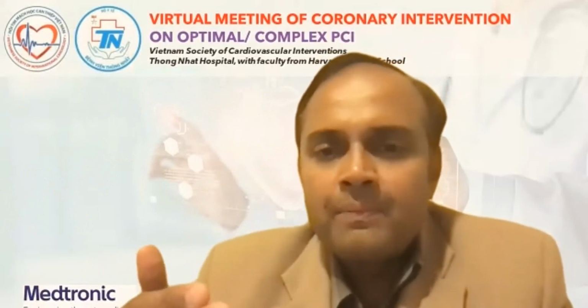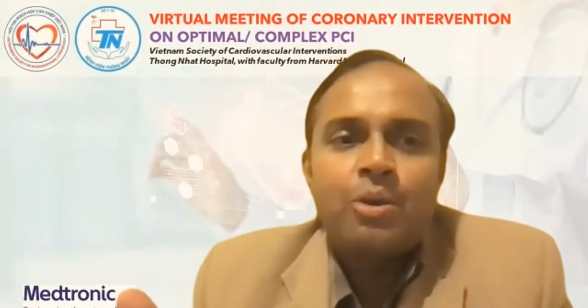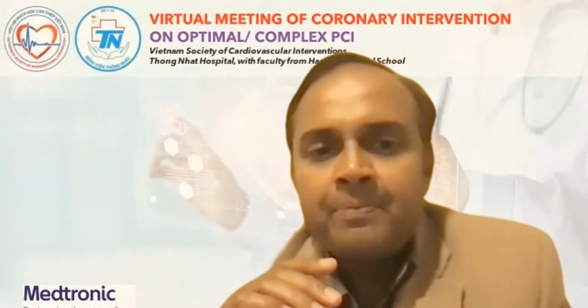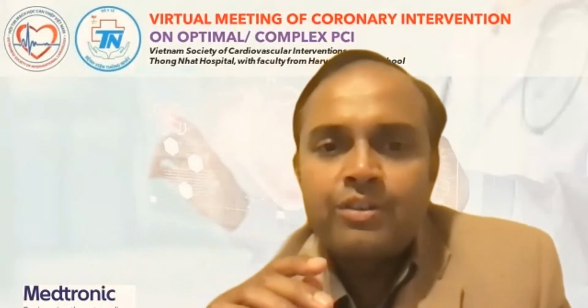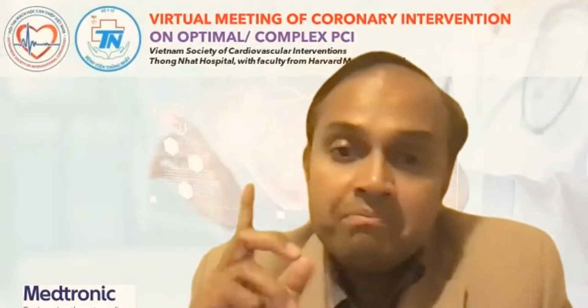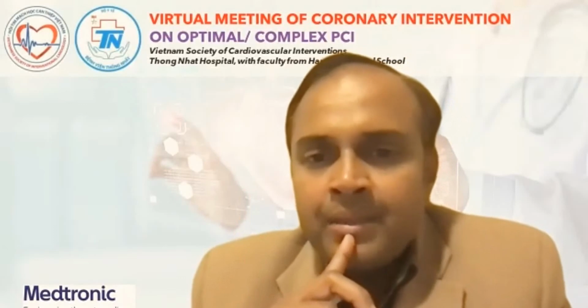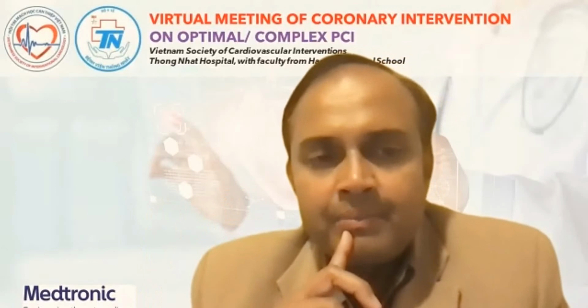even in a dream world where cost is not really an issue, the access complications from the Impella, the vascular issues, whether the iliacs are adequate, access site complications, all of these issues also add on. So we need to consider that as well. A lot of these considerations need to come into play in some of these cases. So yeah, it is not easy. I think I would have erred in favor of having a mechanical circulatory support device, but again, I can understand it can go either way in these kinds of cases.